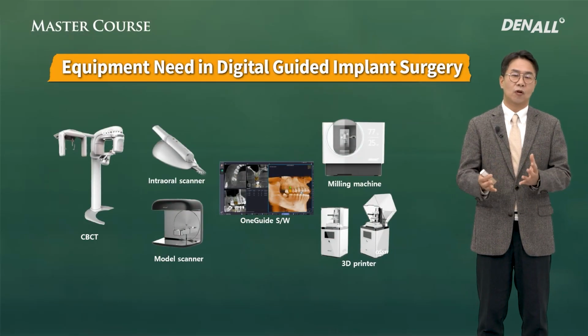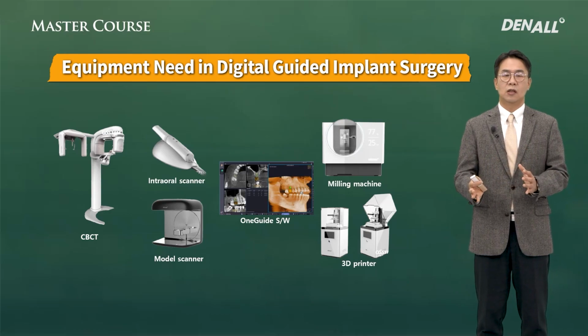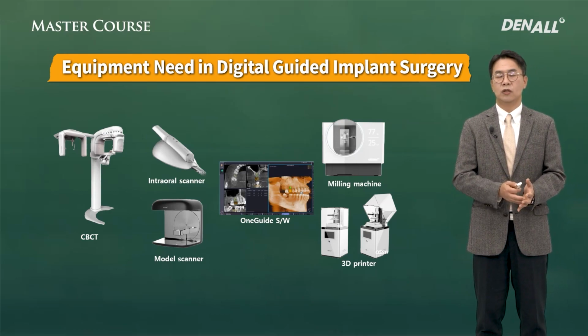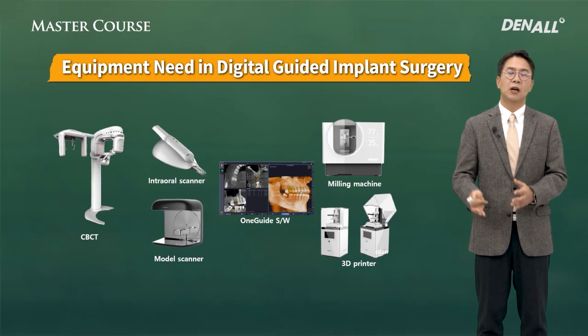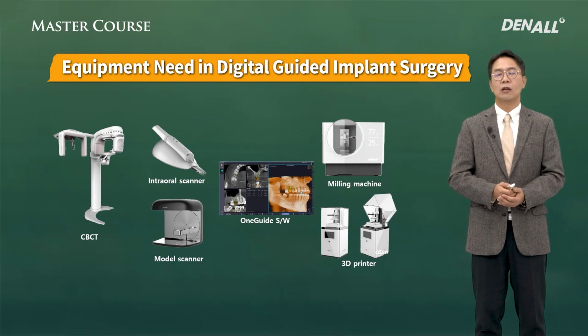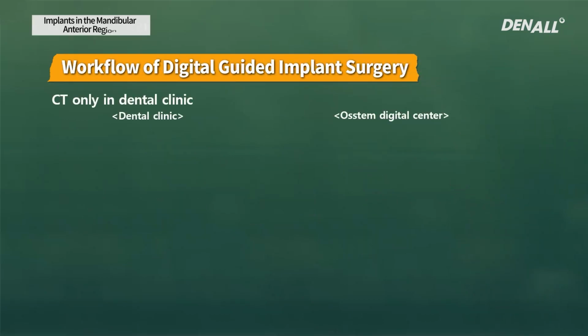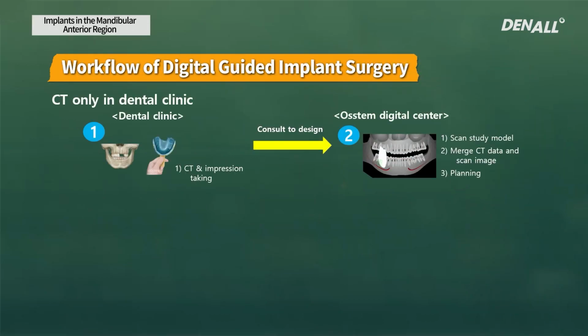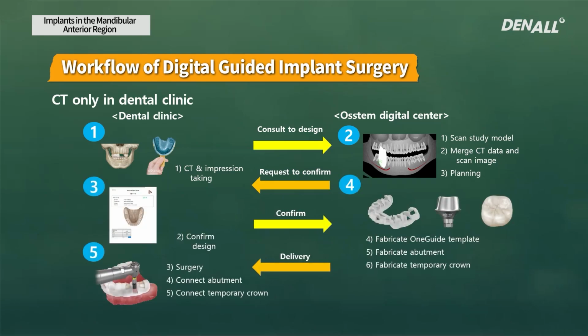There are many different devices available. Today, many clinics have CT machines, so there's no problem with that. It's not easy to have all the machines or equipment beginning with the scanners and software and CAD machine. So this is a step-by-step process and it takes time, and you cannot do it all at once. At each step, you need to take time.